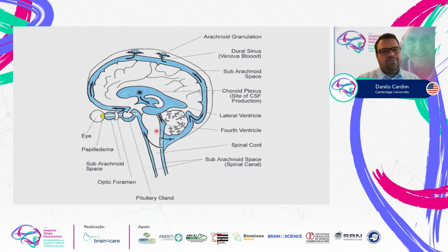So here, for example, this figure represents fluid circulation, where we can observe that the optic nerve located extracranially is surrounded by the subarachnoid space, here represented in blue. And the cerebrospinal fluid circulates freely, and because the intraorbital part of the subarachnoid space is distensible, it can dilate, it can expand when the internal pressure of the cranium increases. So this will be reflected as a dilation of the optic nerve sheath diameter.